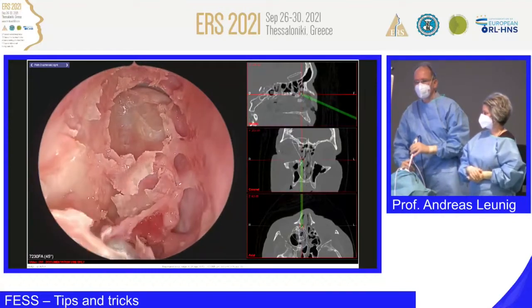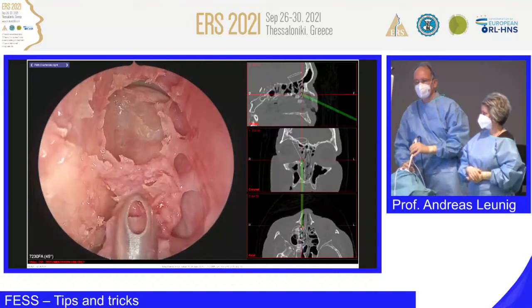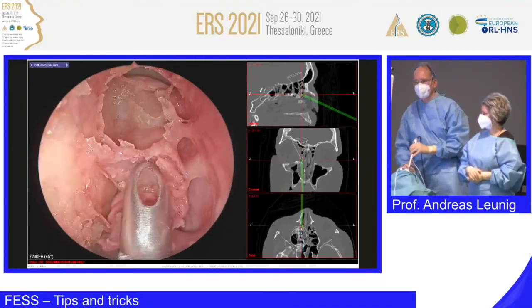Okay, so I take out the mucosa, sorry for that, but it's to show you the bone, the relation of the structures, okay?